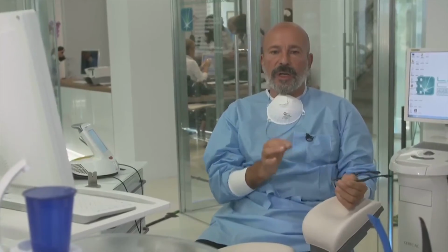So when you work, you can work layer after layer, with a great control of what you are doing. Using a normal scalpel, it's easy to go in a wrong way. Using a fiber, it's easier to control your device, your hand. And always, I will expect hemostasis. So also in my other surgical treatments, as when I want to open a flap, for example, as I want to do an apicectomy, or I want to do a sinus lift, I always prefer to use a laser to open a flap instead of a normal knife. So to us, it gives a lot of benefit.